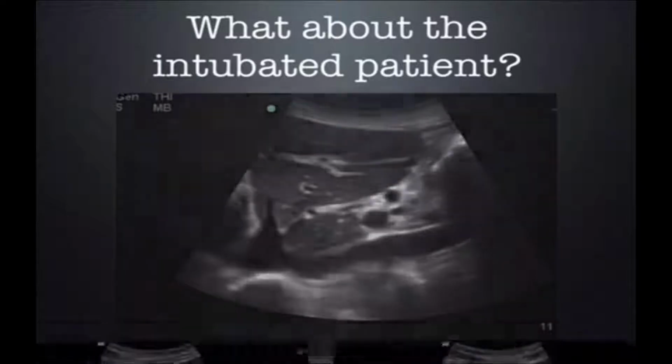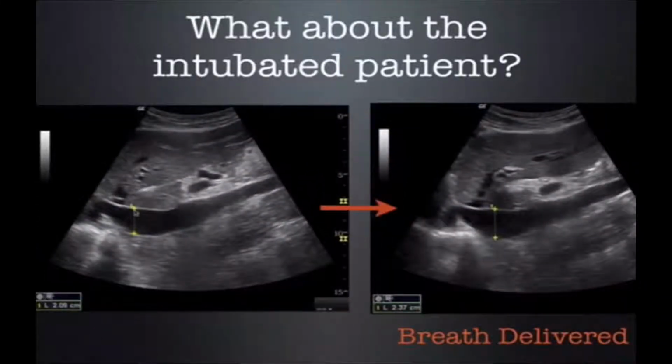In the case of positive pressure ventilation, the IVC is at its smallest diameter at end exhalation. As a positive pressure breath is delivered, the liver and diaphragm descend down just as if you were breathing spontaneously, but that positive pressure provides an impedance to forward flow. It's actually going to dilate the IVC. So effectively, your physiology is reversed.